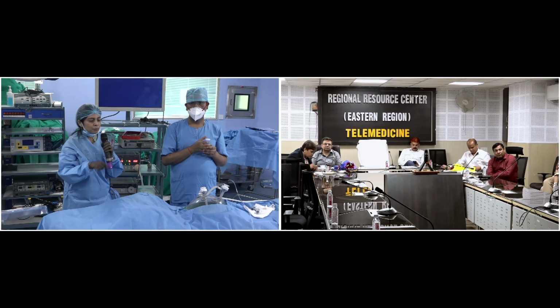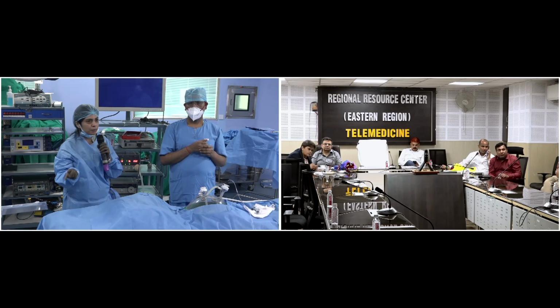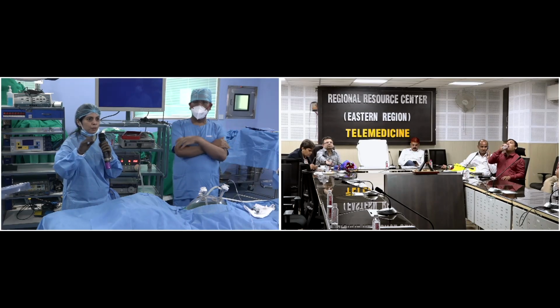All right, and the principle of how PIPAC works vis-a-vis HIPEC. In HIPEC, it's passive diffusion of the drug. So the penetration is about 0.1 to 0.2 mm.